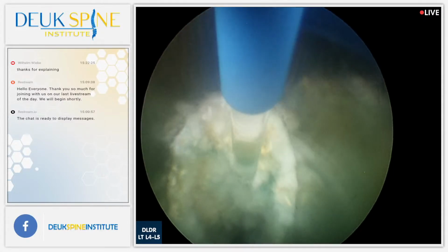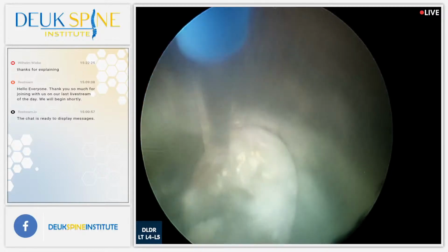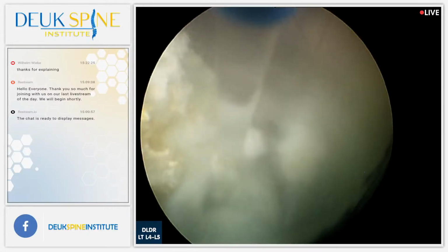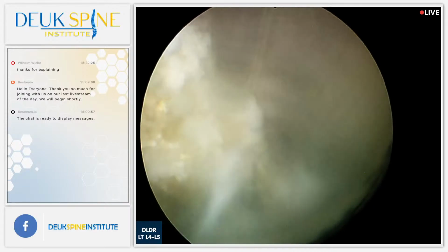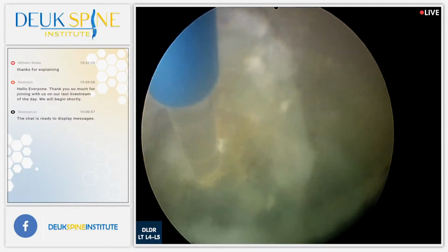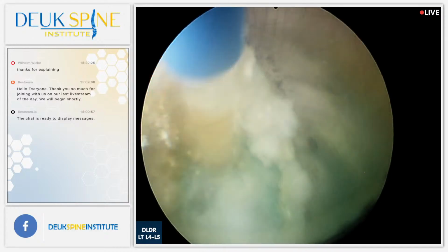You did? I didn't know you did those. And Dr. Berndes tells me he used to do them. And to be honest, they work quite well, you know. They give people good relief for a period of time, could be 6 months, a year. But what you're really doing is you're eliminating the patient's guarding, which allows the doctor, the chiropractor, to fully mobilize the joint that is full of arthritis and scar tissue without the patient stopping them. That's really what you're achieving.